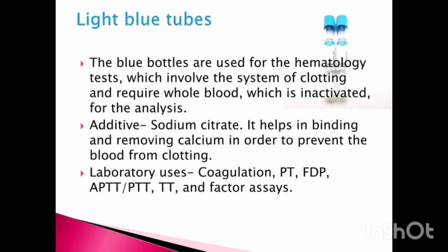The light blue tubes. Light blue tubes are used for hematology tests which require whole blood which is inactivated for the analysis. So it contains sodium citrate. It helps to remove the calcium from the blood and prevents the blood from clotting, and these are used for laboratory tests such as coagulation, PTT, APTT and thrombin tests.